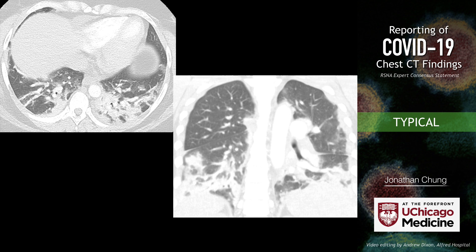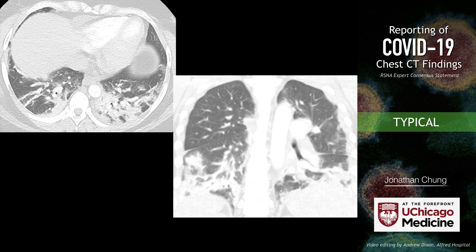I've now seen perilobular consolidation in at least a couple of cases of COVID-19. Here's a patient with COVID-19 pneumonia. We see basilar predominant consolidation with a suggestion of perilobular consolidation and some central lobular sparing. When you have consolidation demarcating the outside of secondary pulmonary lobules at the lung bases, you should be thinking about organized pneumonia. With the high pretest probability of COVID-19, this is something you should be thinking about very highly.